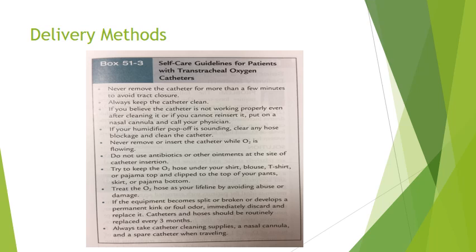They have to always watch their insertion site, and make sure there's no redness, infection, or pus. If their catheter is split, they need to replace it. And they always have to keep it clean and sterilized with vinegar water and things like that. So just a few things to think about for the patient who takes care of themselves with the transtracheal oxygen catheter.